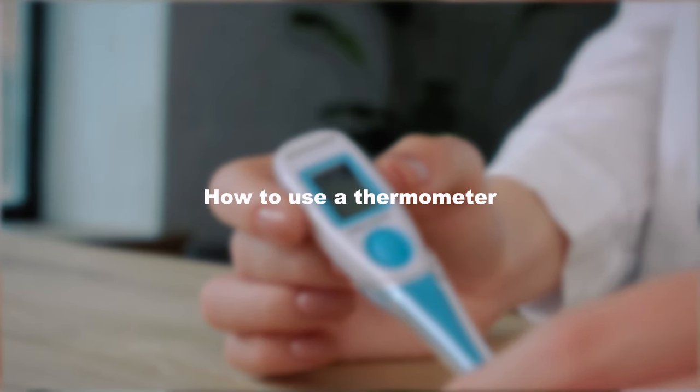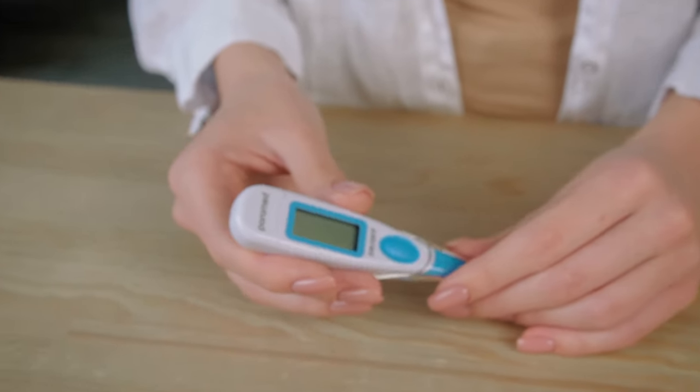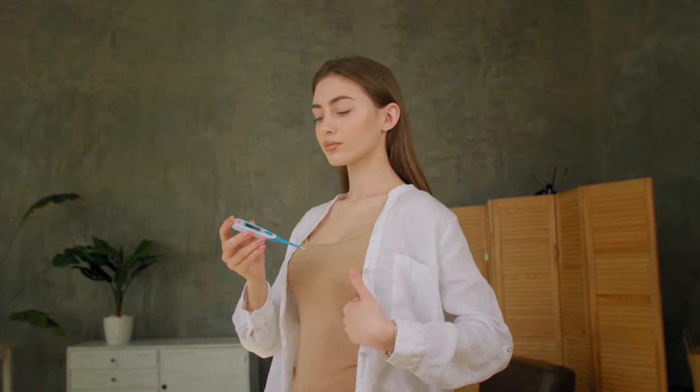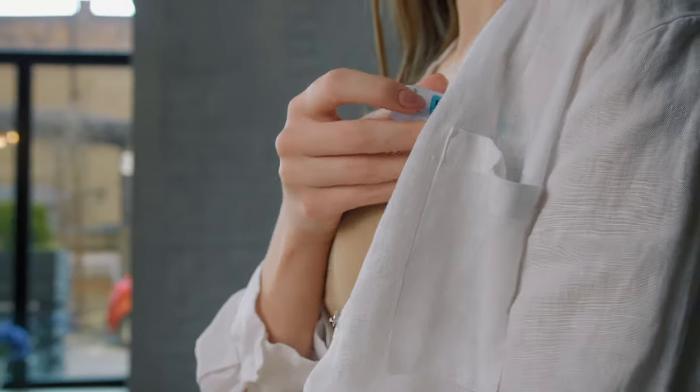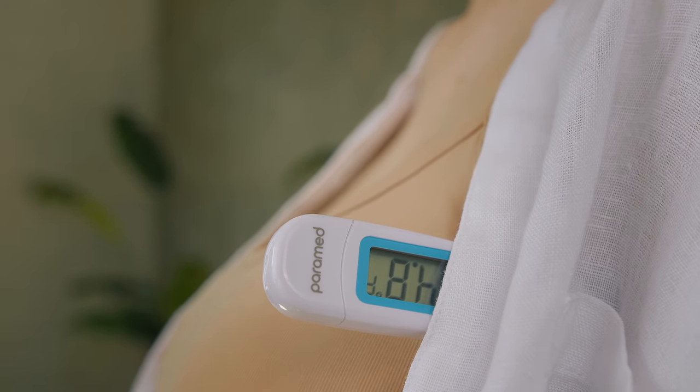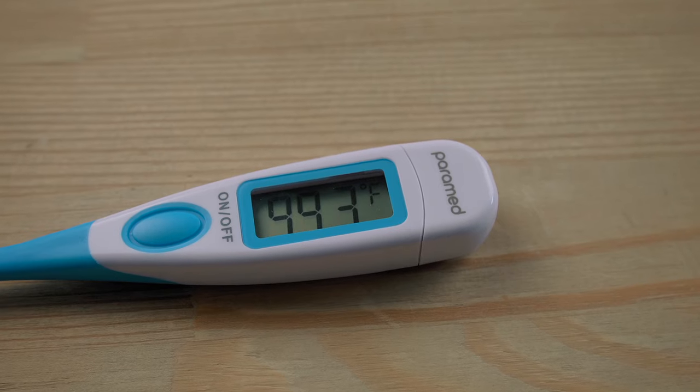How to use a thermometer. To measure the temperature, press the on/off button and place it into the measuring location. The thermometer will notify you with a signal when the results are ready. The signal notifies you that the temperature measuring speed has dropped, therefore we advise you to keep it in the measuring location for a little longer.